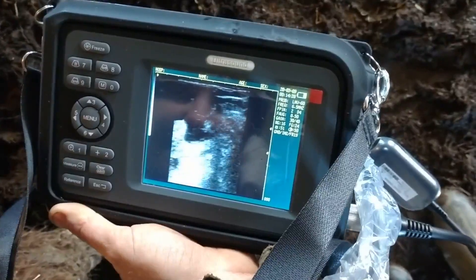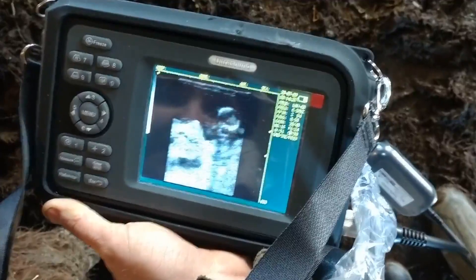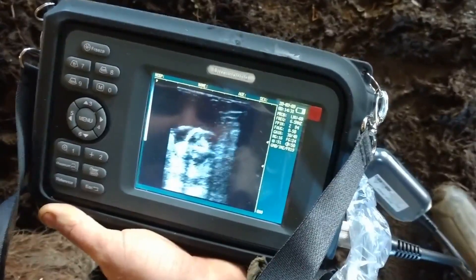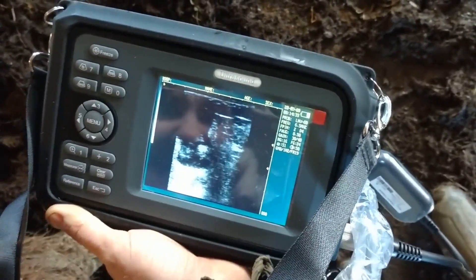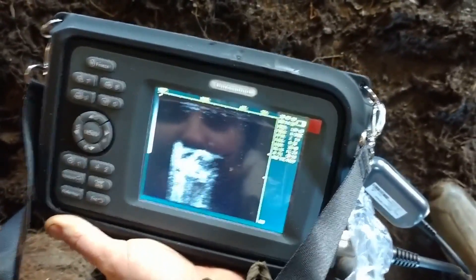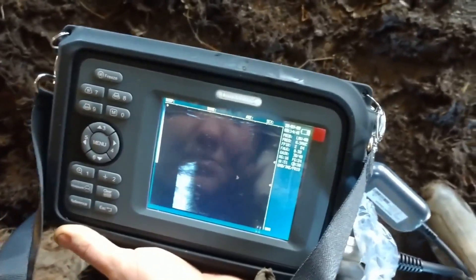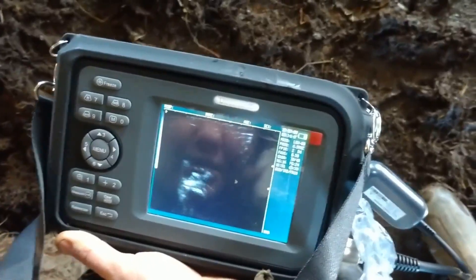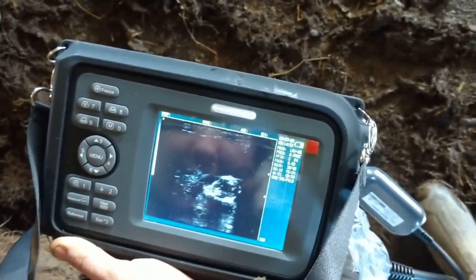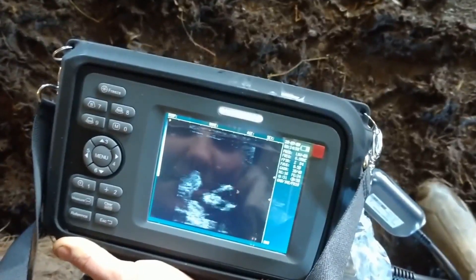That right there would be the baby, just resting in there. So whereabouts is that located in the animal? That is in the uterus, in her left horn. Earlier when I just palpated her myself, I said she was pregnant in her left horn — which she is. This ultrasound is pretty cool because now I can actually see the baby.